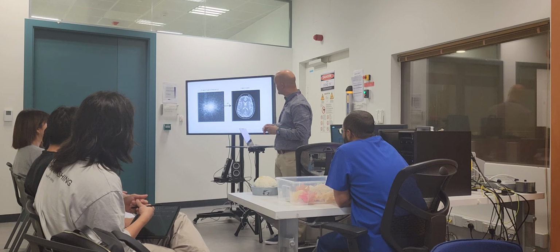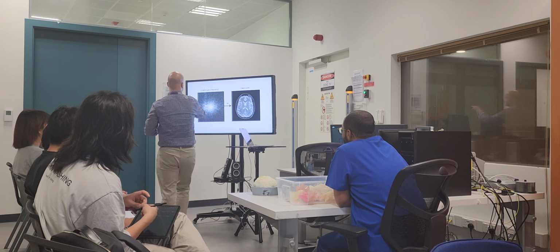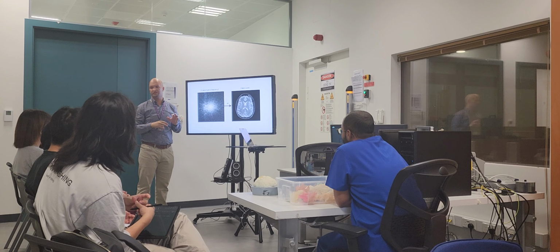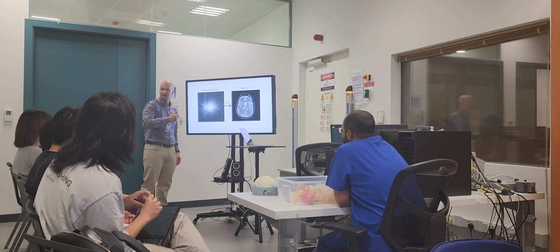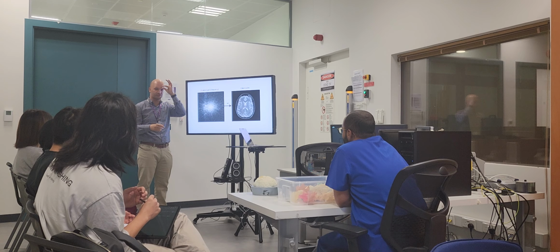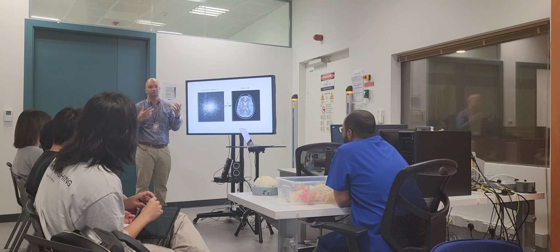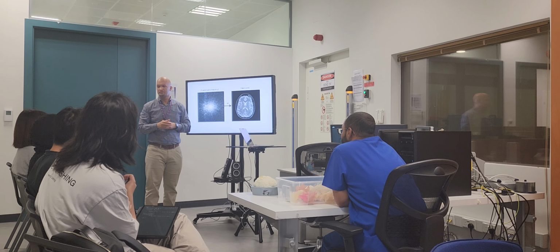Okay. Fast forward. What we do now is every one of those lines is an FID. But we play with the gradient in the x to go from here to there. This is an x gradient. To blip from this line to say this line, I have a y gradient. So I play with the gradients x and y and z. I select a slice, and then I have a 2D space. Then I can traverse this 2D space by playing x and y gradients with a pulse sequence. With a Fourier transform, I get it.